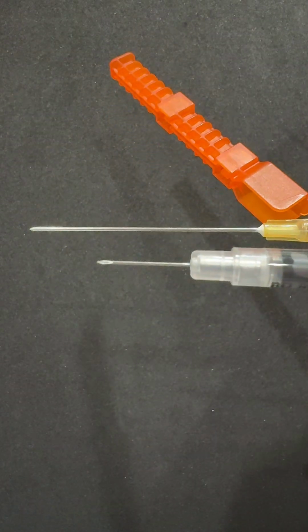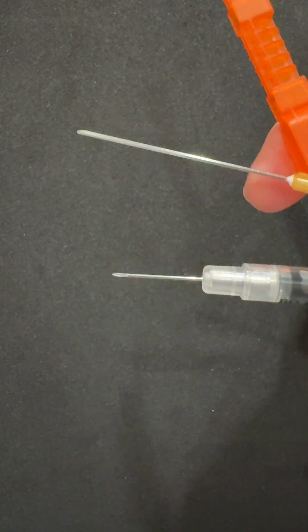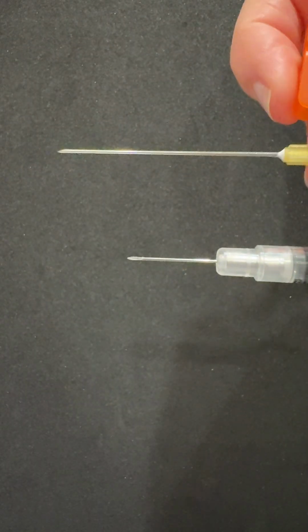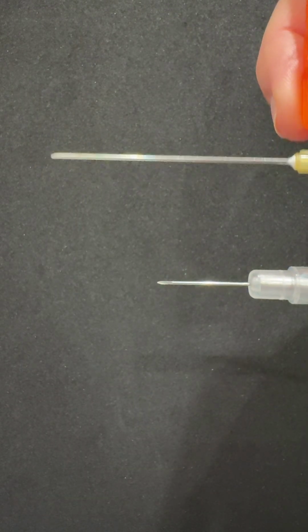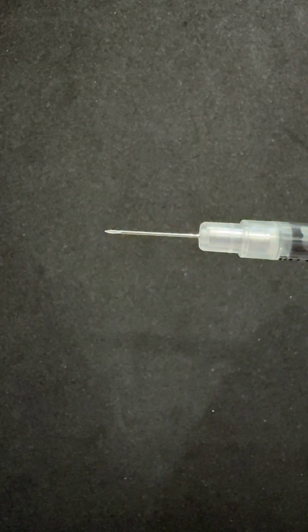Do you see how much thicker this is? This one is a 21 gauge, so it's a lot thicker, wider diameter, and it's a lot longer. This one would be given for an IM injection. This is the correct length we would need for a subcutaneous injection.